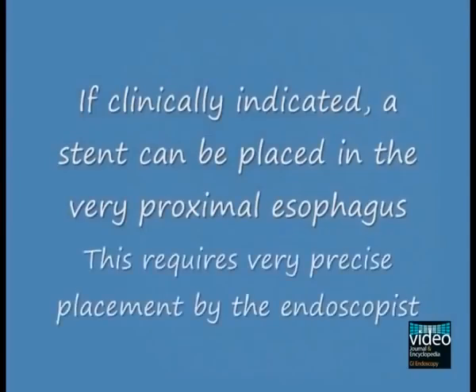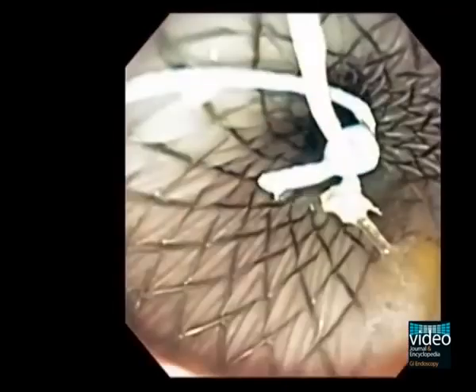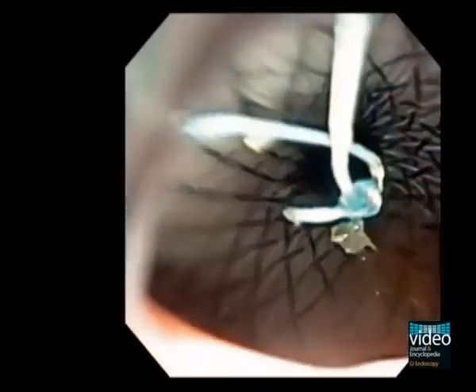If clinically indicated, a stent can be placed in the very proximal esophagus. This requires very precise placement by the endoscopist. Here you see a fully covered stent placed immediately below the upper esophageal sphincter in a patient with a very proximal cancer. This patient tolerated the stent well.